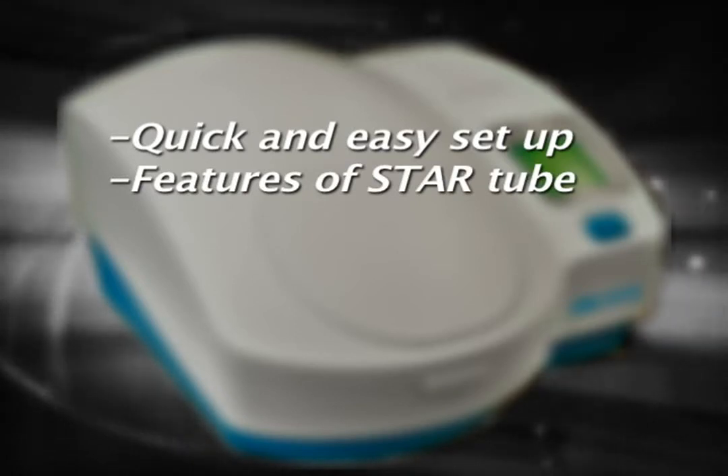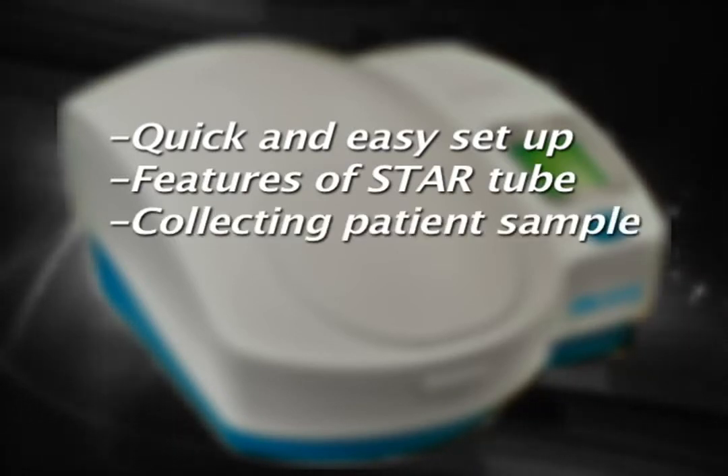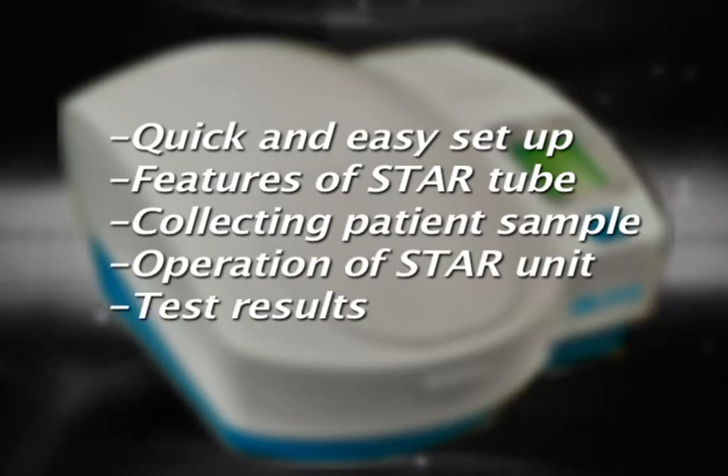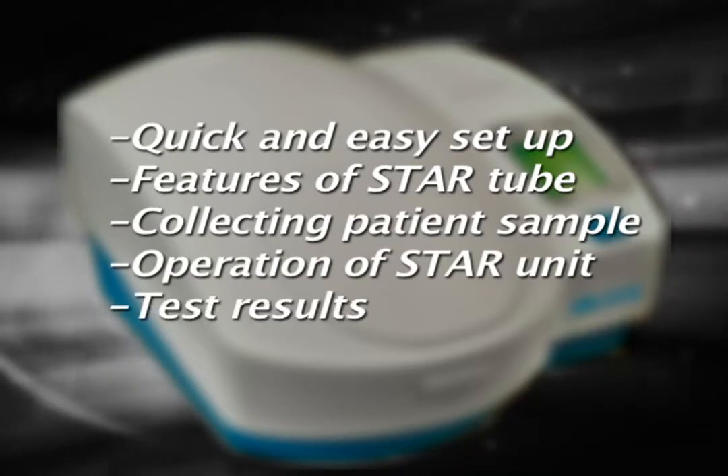Hi, my name is Isabella Rinaldi and I'm a Senior Research Associate with QVC Diagnostics. Today, I'd like to give you a brief demonstration of the QVC STAR Hematology System, including the quick and easy setup of the STAR system, the features of the specially designed STAR tube, how to collect a patient sample for testing, the simple operation of the STAR unit, and the hematological parameters assessed by this system.